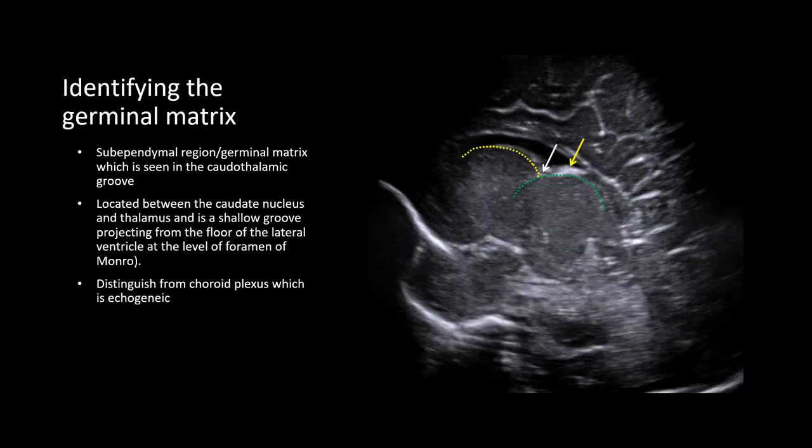The germinal matrix is located in the subependymal region, in what is called the caudothalamic groove — between the caudate nucleus, seen in the sagittal view outlined in yellow, and the thalamus, outlined in green. It is a shallow groove projecting from the floor of the lateral ventricle at the level of the foramen of Monro. Be sure to distinguish the germinal matrix from the choroid plexus, which is echogenic and indicated by the yellow arrow.